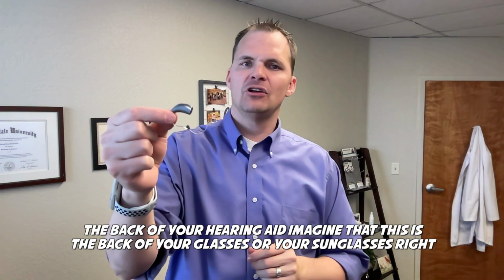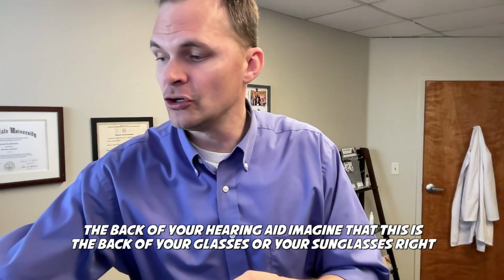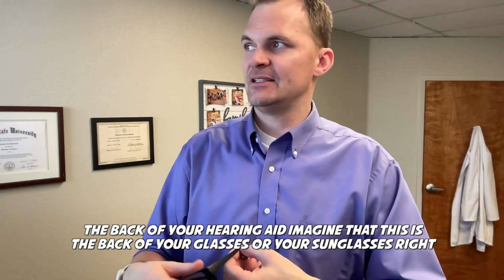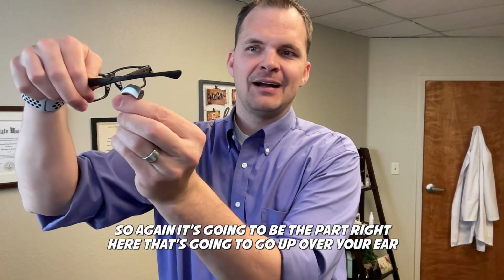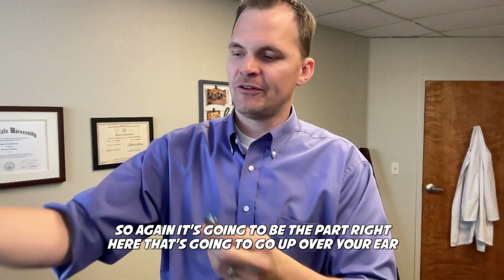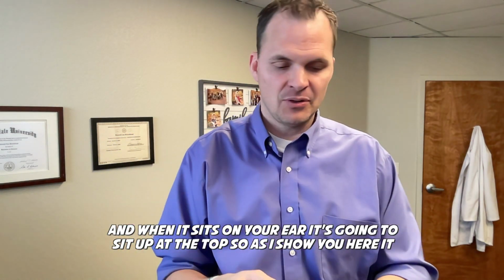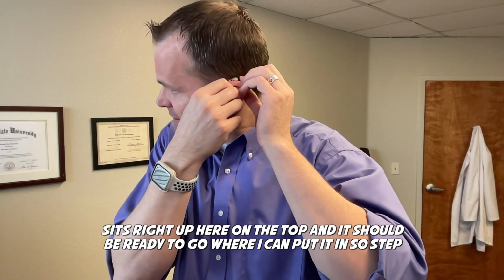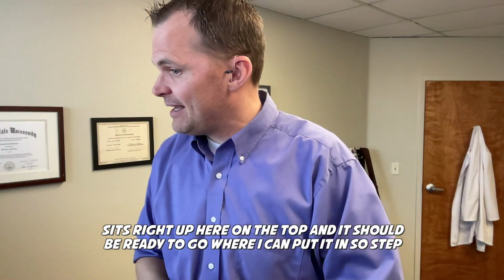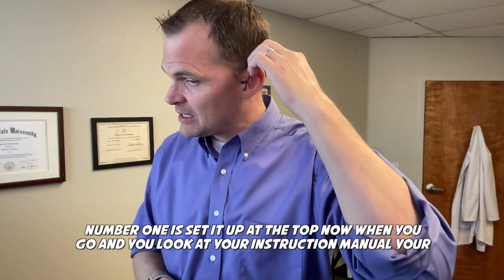The back of your hearing aid, imagine that this is the back of your glasses or your sunglasses, right? So again, it's going to be the part right here that's going to go up over your ear. And when it sits on your ear, it's going to sit up at the top. So as I show you here, it sits right up here on the top, and it should be ready to go where I can put it in. So step number one is set it up at the top.